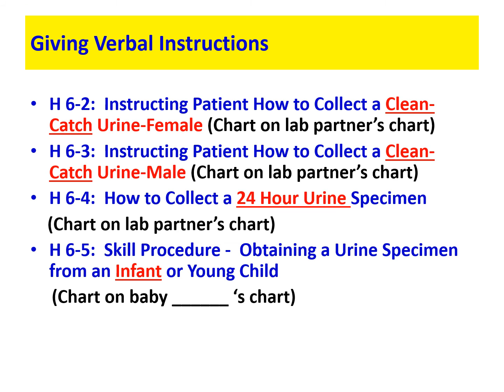We typically give them a urine cup they can take home with them, as it is easier to collect it usually in a urine cup. So we tell them when they wake up in the morning, they need to note the time. Most people wake up around the same time every morning, and most people usually go to the restroom not too long after awakening. So they go into the restroom, they note the time, say 5:30, and then they urinate. We do not keep that specimen.